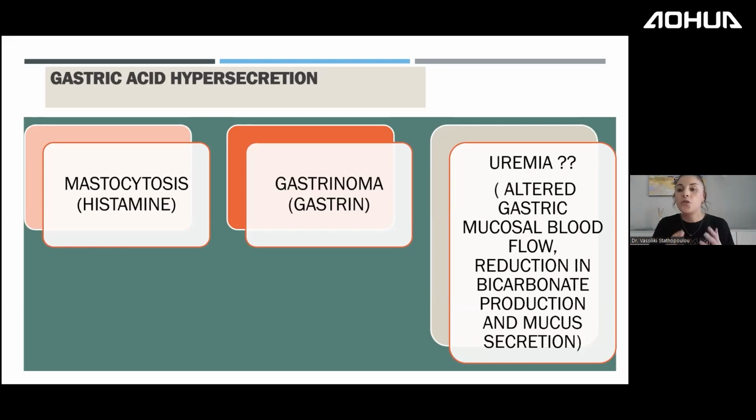and bumps. Do a thorough clinical examination, because these dogs will probably be scoped and you will find nothing, because it could be not systemic mastocytosis, for example. Could be just skin disease. So stick a needle and do an FNA before you do endoscopy. I know that Aohua will kill me now for saying that, but please do a very thorough clinical examination. Okay.